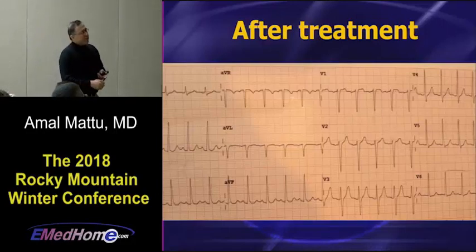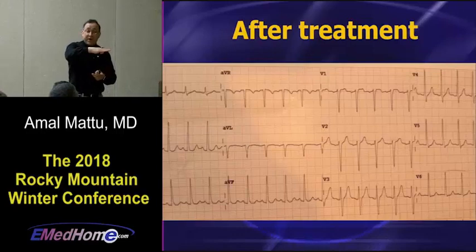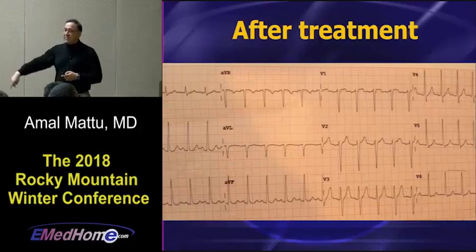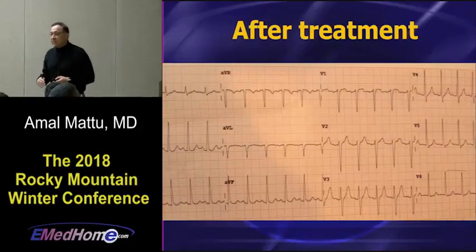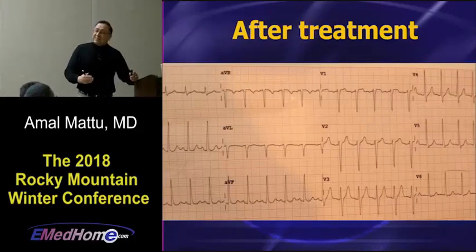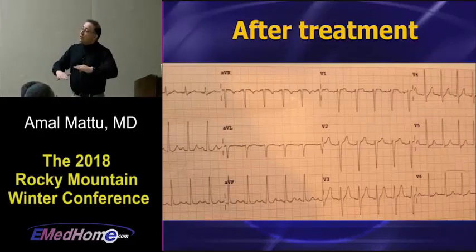And I remember learning that the P wave gets smaller and goes away. So sometimes it can mimic VTAC because you've got a wide QRS and no P waves. And I also learned about the sine wave, right? Everybody learns about the sine wave, or I guess if you're from the southern hemisphere, you call it a cosine wave, I don't know. But everybody learns about that. But ST segment changes, nobody ever taught me about that.